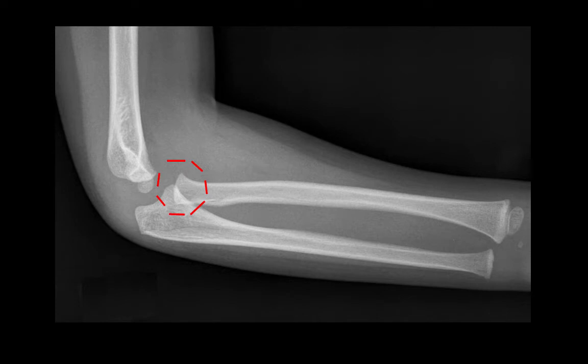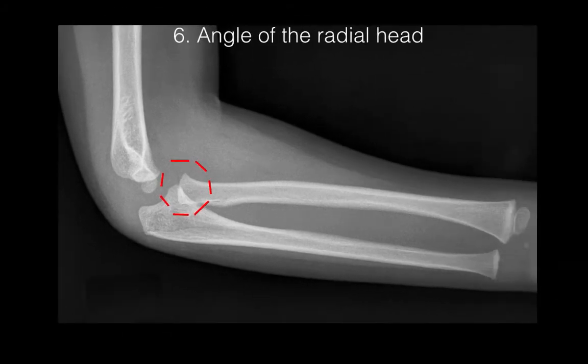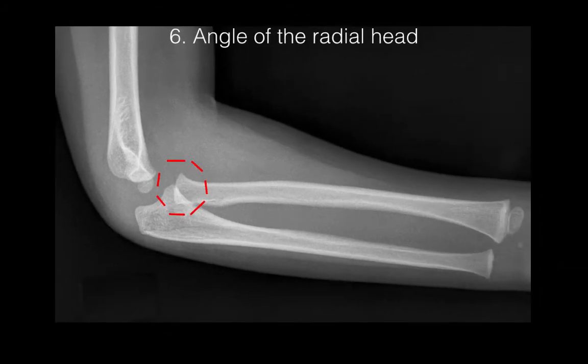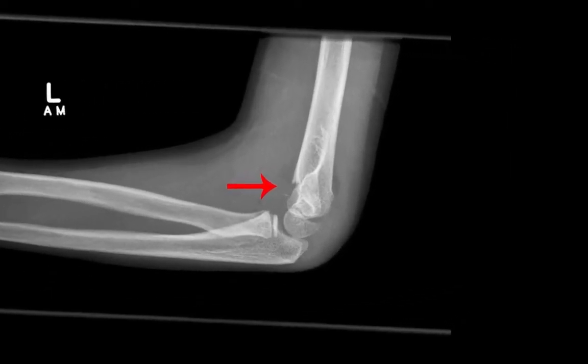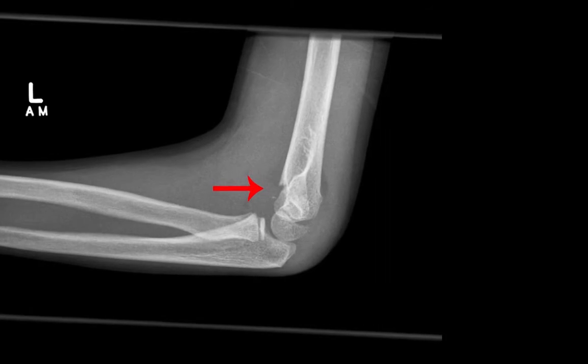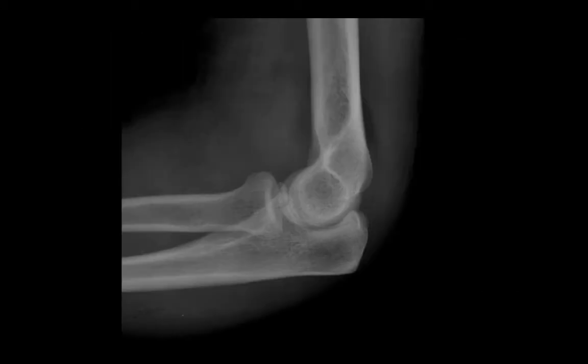The next one is quite subtle. We can see that the radial head, indicated by the dashed red circle, is tilted slightly superiorly. If there is an abnormal angle of the radial head you need to think that it might be fractured. This red arrow is pointing out a fairly obvious fracture of the distal humerus — just like any orthopedic injury we need to look for disruption of the cortex. In some cases it's subtle, as with the coronoid process of the ulna bone in this lateral film, which is fractured.